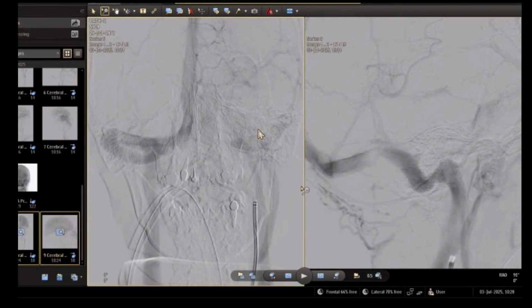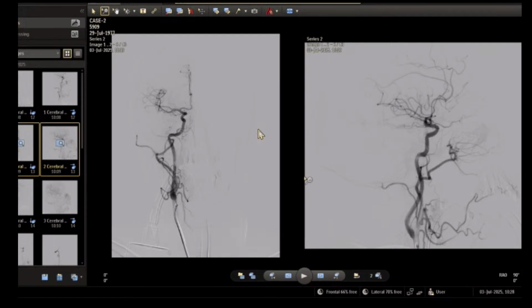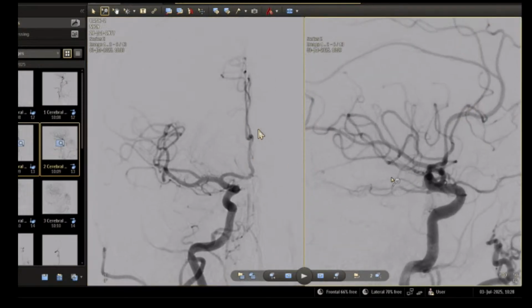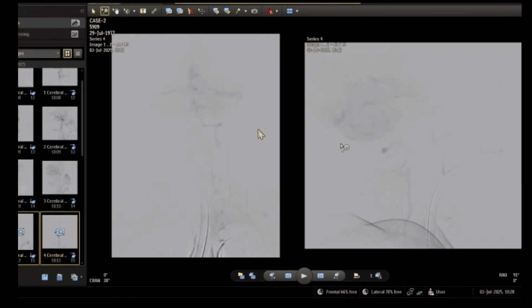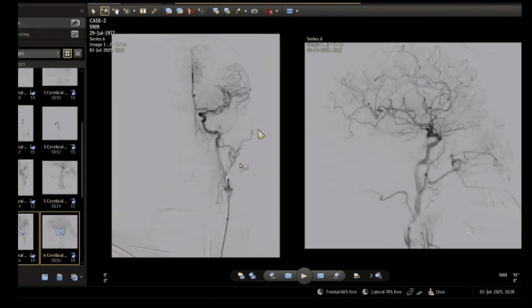Okay, we discussed with the patient first of all, and because of the fear of the patient, we will treat the ICA aneurysm first. On the right side there is no aneurysm, but the radiology report mentioned some enlargement in the ICA territory. The ICA territory looks clear. There is a PCom artery and everything looks good. I think the only one is the microaneurysm on the ophthalmic segment on the left side.